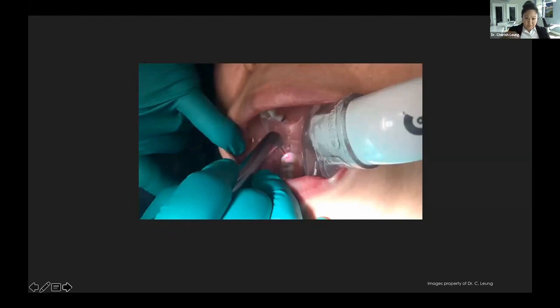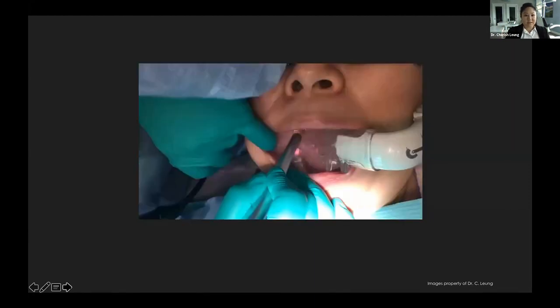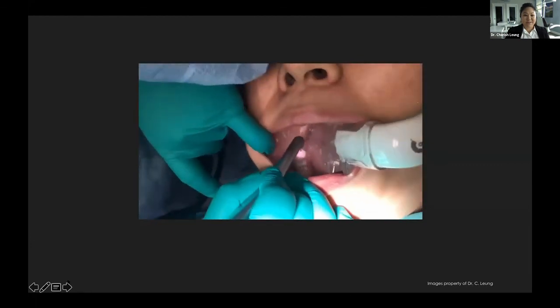So I just prepared a tooth here. I actually removed a composite with this with no local anesthesia, and it was really easy because the composite melts away like butter under the laser, and you can really tell the difference. Sometimes when you're using a handpiece, it's harder to tell whether you got all the composite or not, but with the laser, you can totally tell.